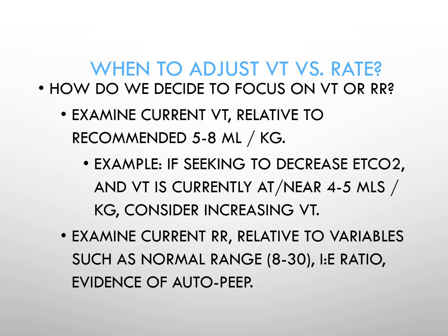So it's not limitless. You're not going to increase your tidal volume irresponsibly. If you're using ARDSnet and the patient has very, very stiff lungs, then you may just be left with no alternative than to work the rate. But when you have that latitude and the patient's compliance is reasonably okay, then in that particular example, consider increasing the tidal volume.